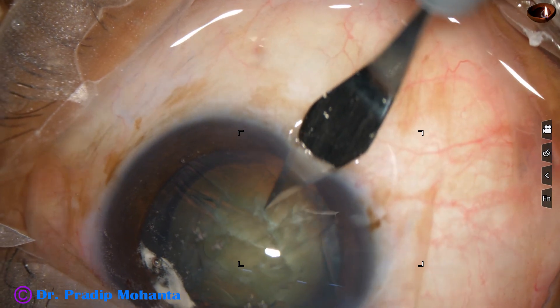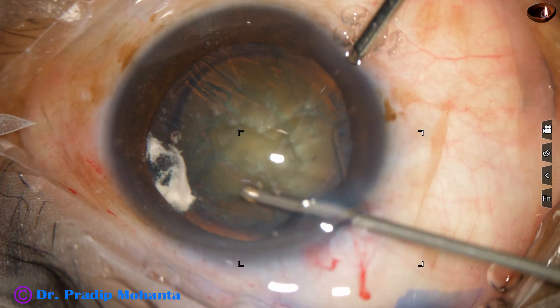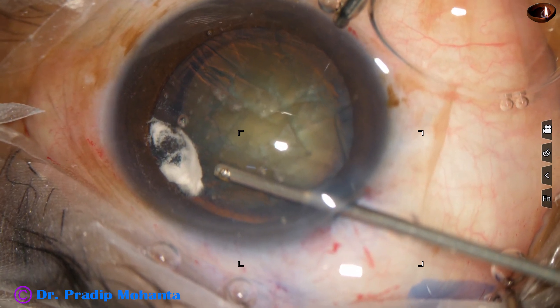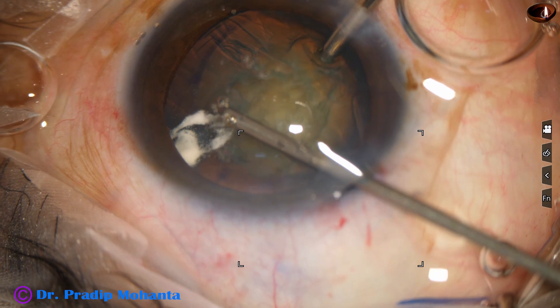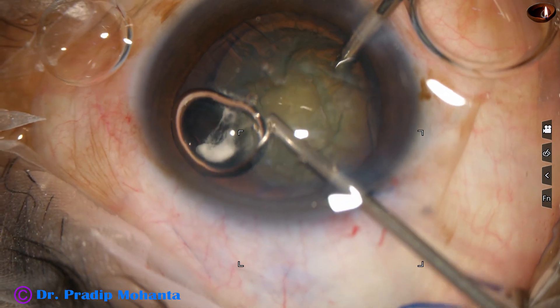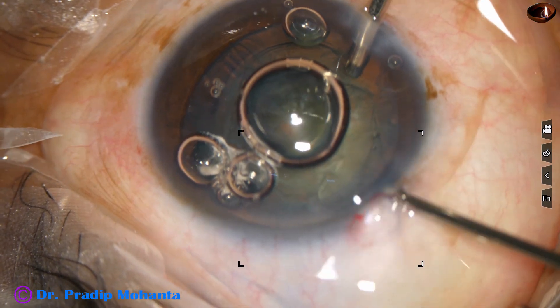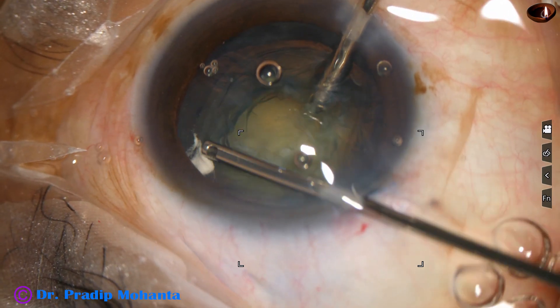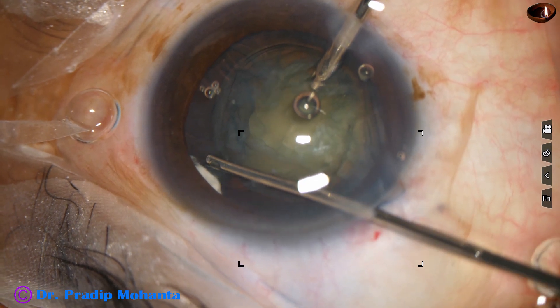I make a side port at 7 o'clock and try to shave this knuckle with the vitrectomy cutter. I decrease the bottle height to about 30 cm. This cutter is not functioning — it was used earlier and sterilized with ETO and it is not functioning. So immediately I use reflux, come out, take another new cutter and cut this knuckle of vitreous. I am careful not to cut the iris.